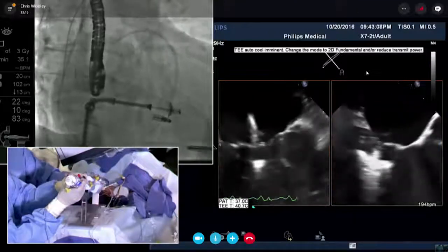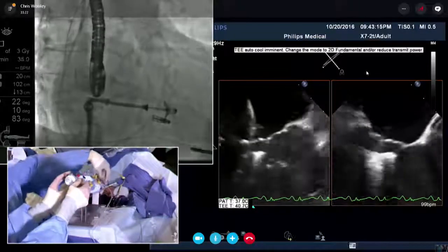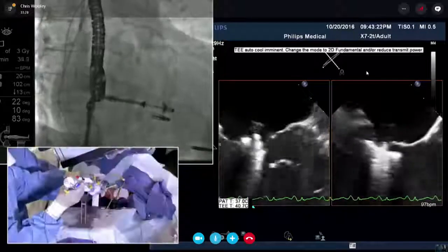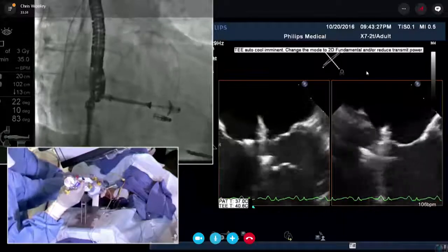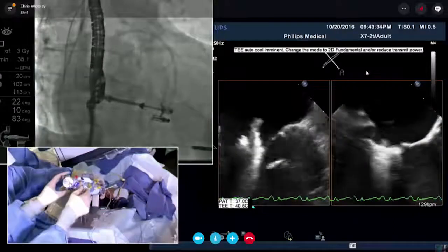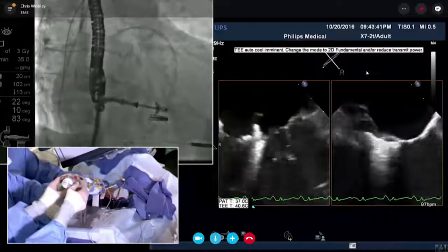And clockwise the guide. A little more posterior leaflet. Yeah. Clockwise more. Yeah. Clockwise more. So you may have to. It's not transmitting. Not anterior. Then he's not getting the posterior leaflet. That's better. No, still not getting it. Setting 100. Okay. Good. Like that? Yeah.